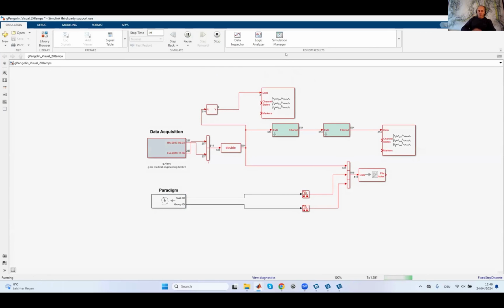The diameter is so small that it's also a reason why the impedance is higher than with standard EEG electrodes. That's why we have the preamplifier here in black, very close to the pangolin grids. Otherwise, you would get a lot of interference and power line noise.